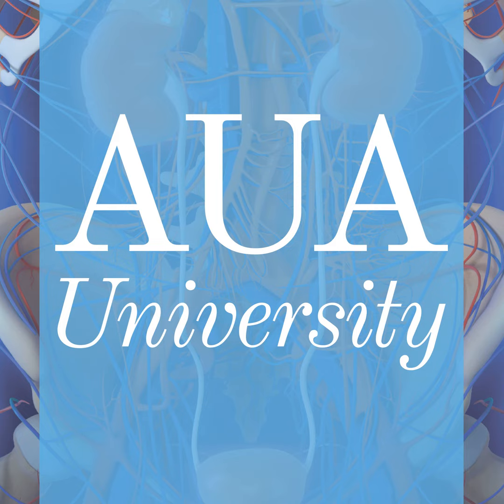The primary outcome was the detection of pelvic nodal disease, which was noted in about 40 patients based on PSMA PET, or 14%. Unlike the pro-PSMA trial, all patients in this study underwent radical prostatectomy with pathology as the gold standard.